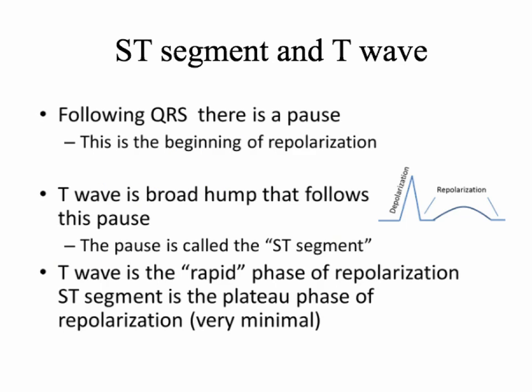Then the next thing you're going to get is the ventricles are going to repolarize. So they've depolarized. Now they have to repolarize and get their negative charge back. And that's seen by the T wave.